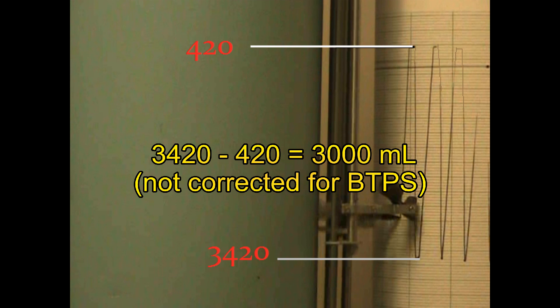For the purpose of this demonstration, I am not correcting this information for body temperature and pressure standard.